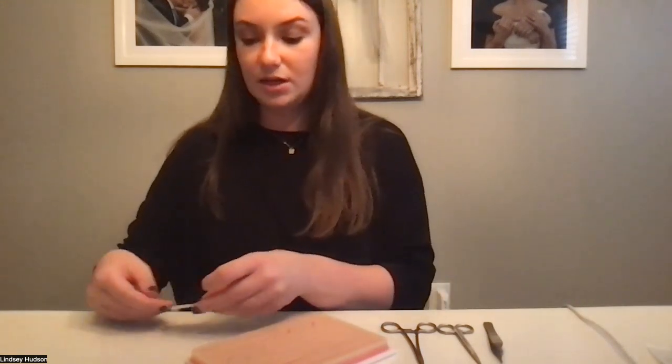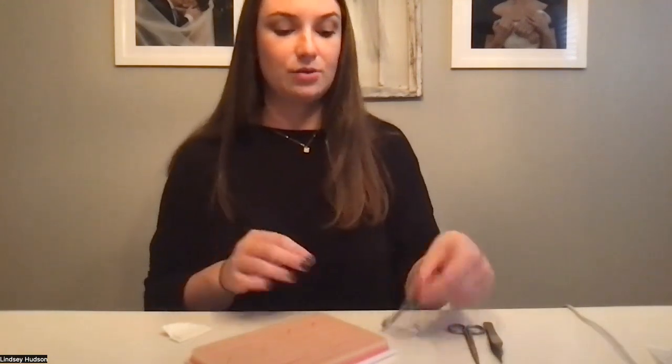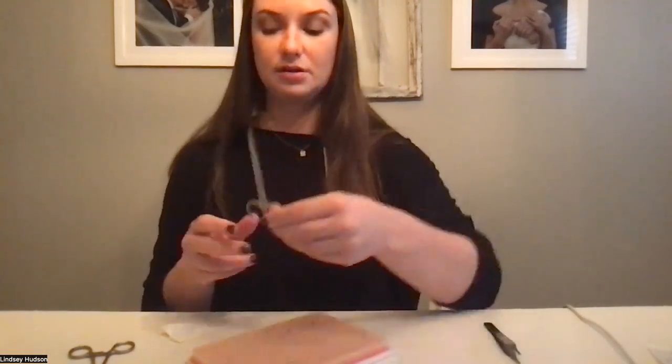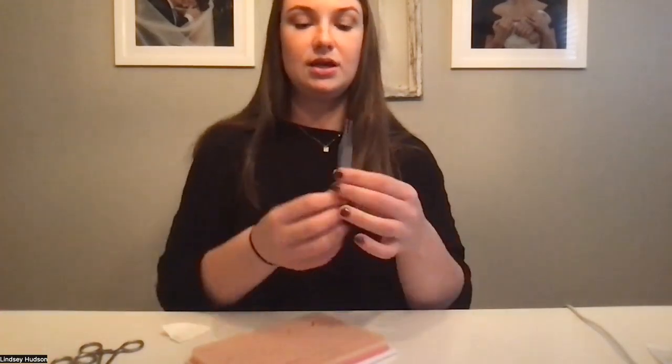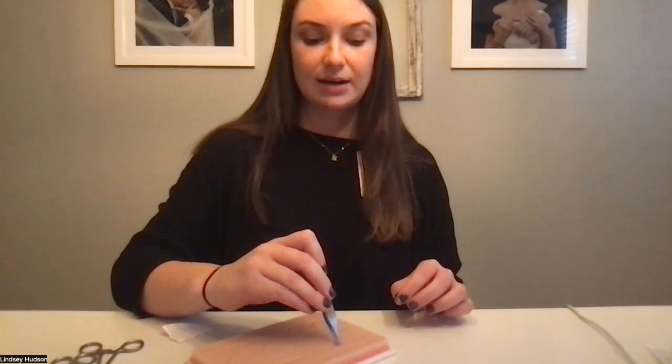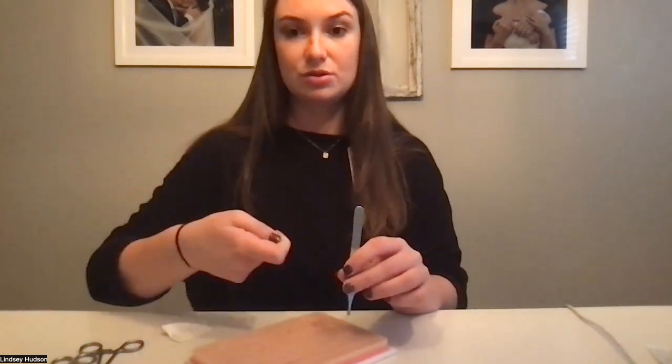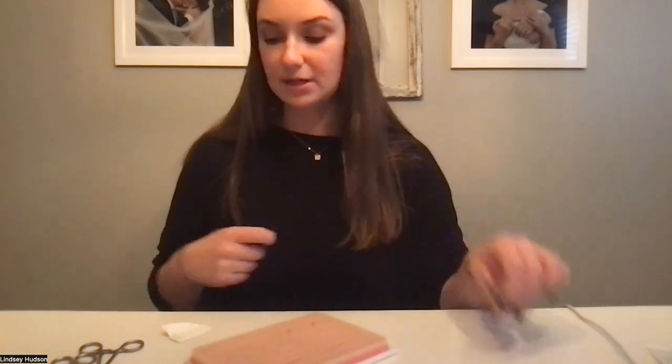So the things that you would need to do your sutures is your sutures. You would need your needle drivers. You need a pair of scissors, and then you need your forceps with teeth. And the forceps with teeth, if you need help grabbing onto the skin to help you get control to do the sutures, you would use your forceps then.